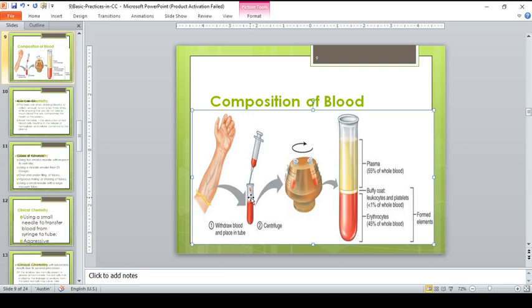But if you put a whole blood in a tube with an anticoagulant, you will obtain plasma after the process of centrifugation. Okay? So, kapag may anticoagulant, you will have plasma. Pag walang anticoagulant yung ginamit na tube, you will have serum. Okay? So, we have here, since this is termed as plasma, most likely it was placed in a tube with an anticoagulant.